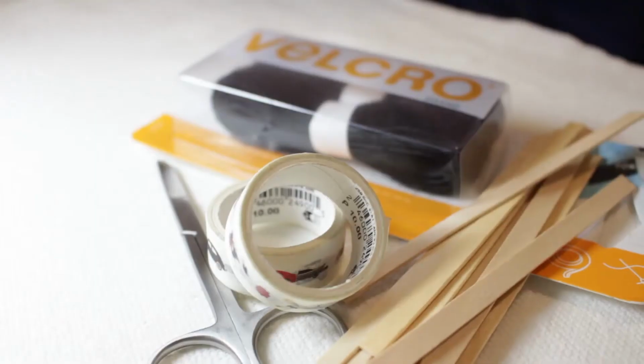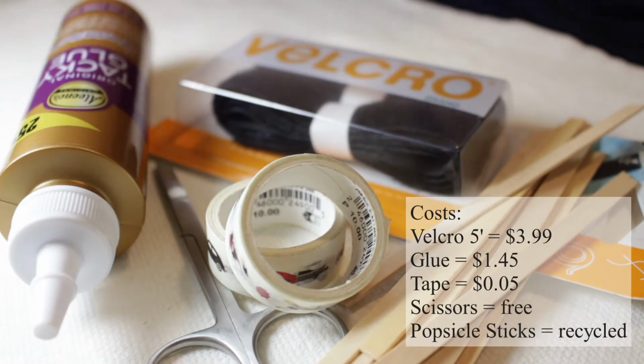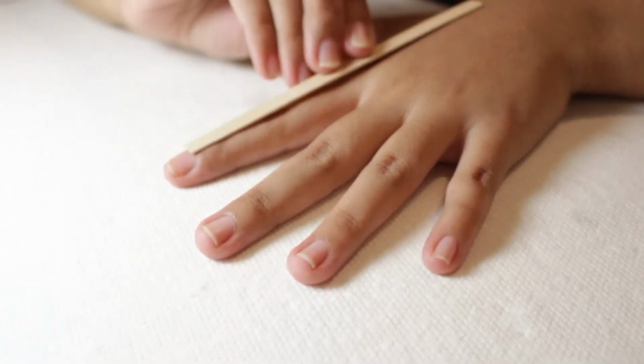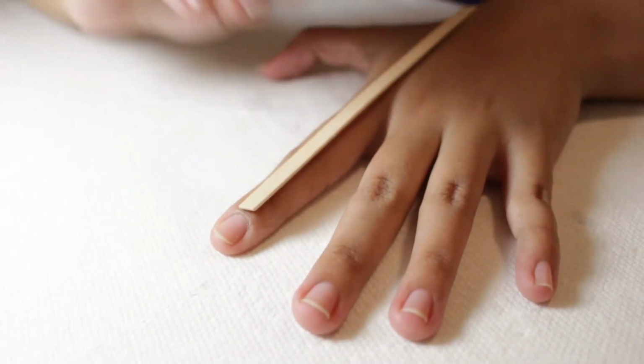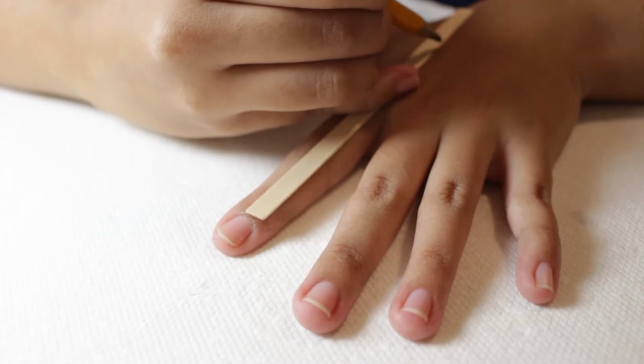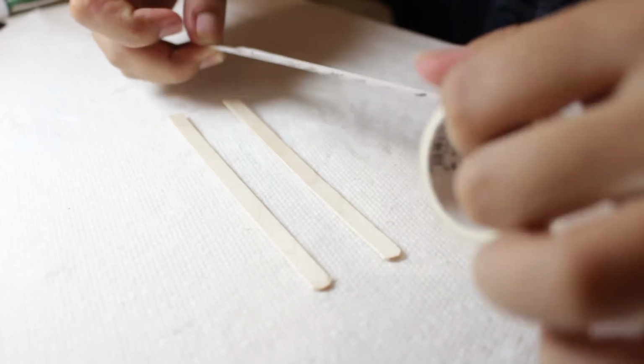See, it's hard to bend. You will need decorative tape, glue, popsicle sticks, a pair of scissors, and Velcro. Start by measuring out the popsicle stick from the base of the nail to the base of the metacarpals and cut off the excess. You will need 2 pieces of this popsicle stick.